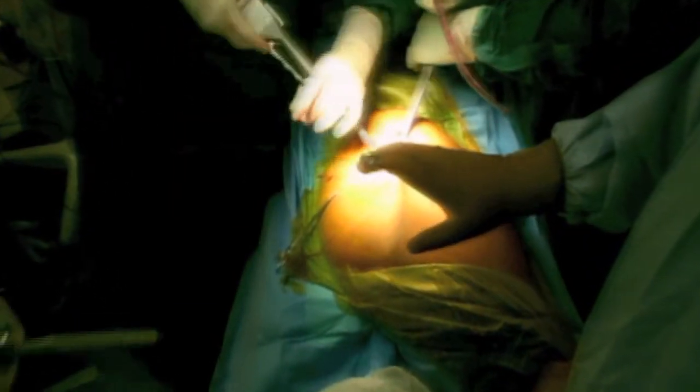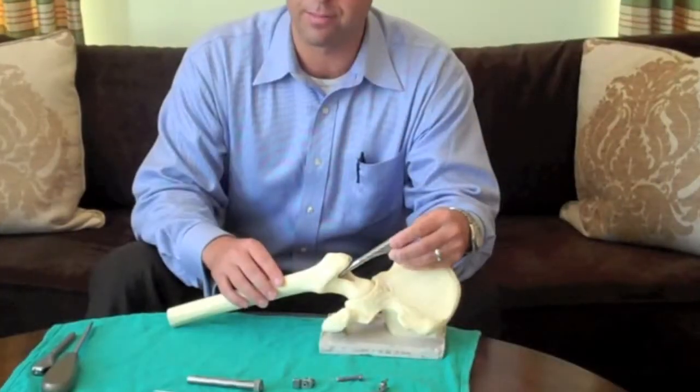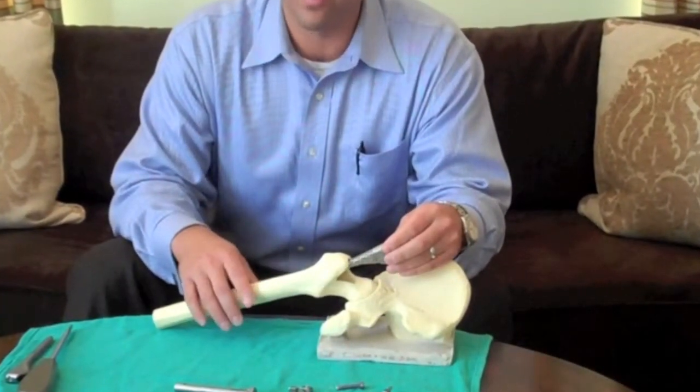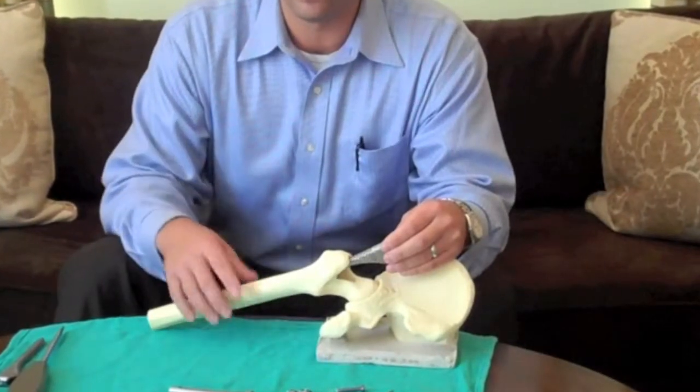In-Site-2 Femoral Preparation refers to implanting a femoral broach without dislocating the hip, without cutting the femoral neck. This is basically just like implanting an IM femoral nail. It was developed by Dr. Stephen Murphy as part of his superior approach.